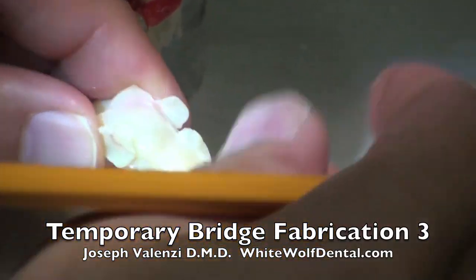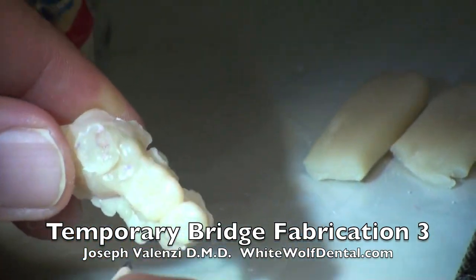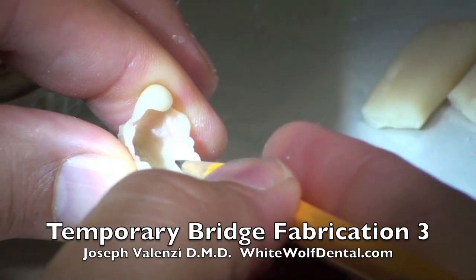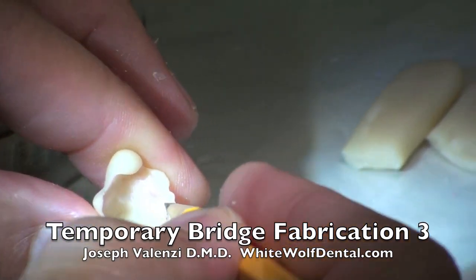We've relined it. Now the margins are all bulky and like that, but the inside's looking nice. I can actually see my margins.